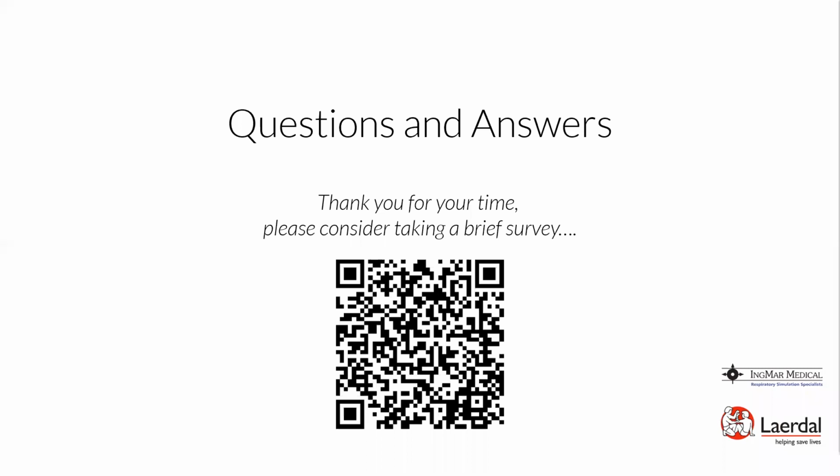Great. Amy, will you speak to running these scenarios if someone does not have an ASL 5000 and what that may look like? Sure. So you can use the ASL plugin in virtual mode, but you do lose some of the effects of the scenario because you're not having the ventilated breaths come through.